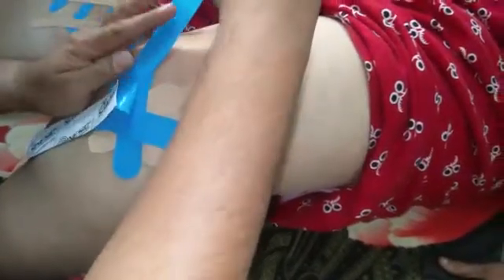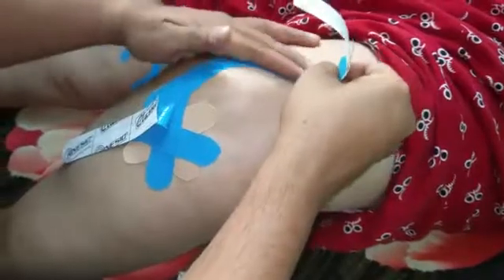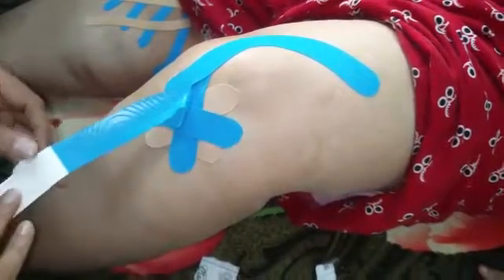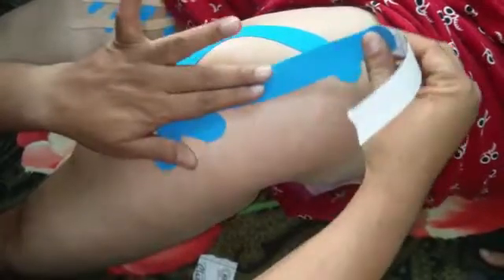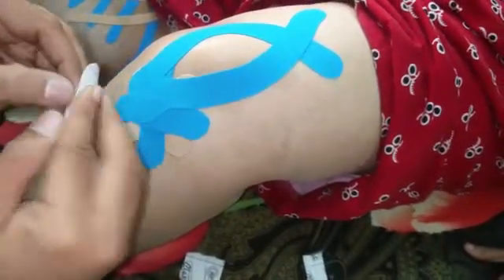After this, with a slight amount of stretch — because we are already doing this in flexion — the tape should form wrinkles when the knee is extended. So with slight stretch, we are applying this over the knee joint in order to localize the patella and prevent pain.